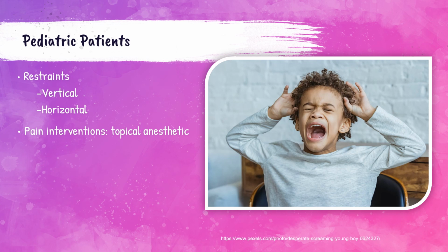Unfortunately, sometimes the techniques on the last slide do not work for every patient. So some children are unable to be held or calmed by parents or distracted. In that case, a restraint may be required. Sometimes a topical anesthetic can be used to numb the area, but this is only if it's allowed in the facility's policies.